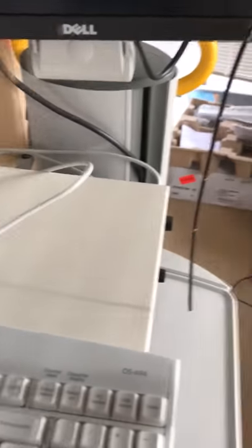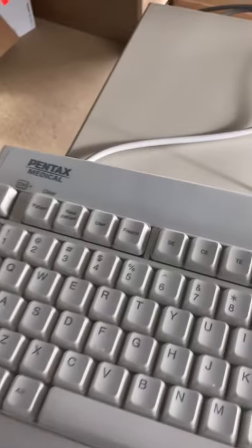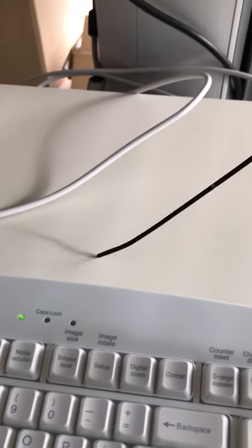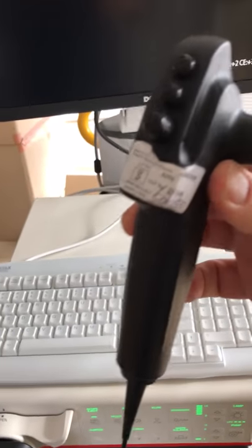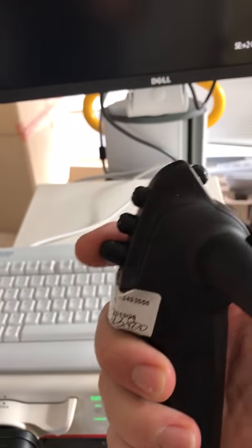It's a beautiful scope — 130 by 130 degree deflection. Absolutely beautiful imaging. We'll go through the imaging in a second. The deflection is 130 degrees, and it has a lovely sleek profile.